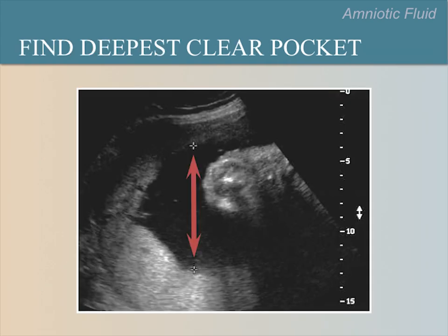Look through the entire amniotic sac to find the deepest pocket and measure the depth. Notice that the calipers form a vertical line — meaning straight up and down — that does not cross the umbilical cord or fetal parts.